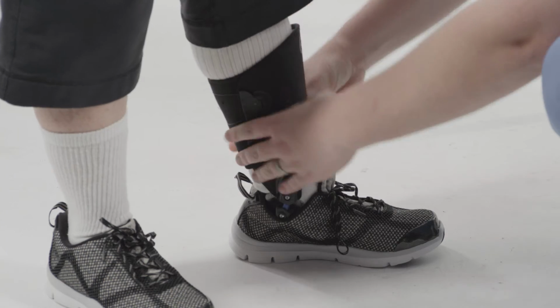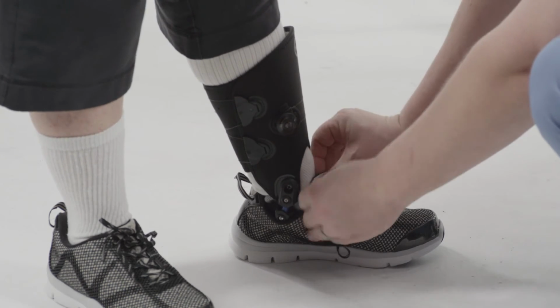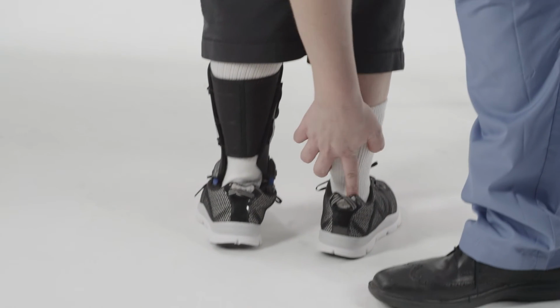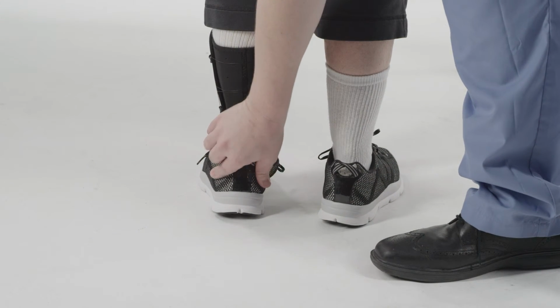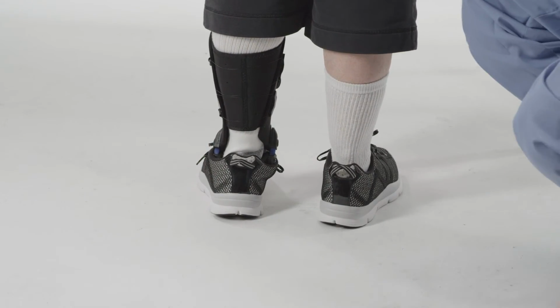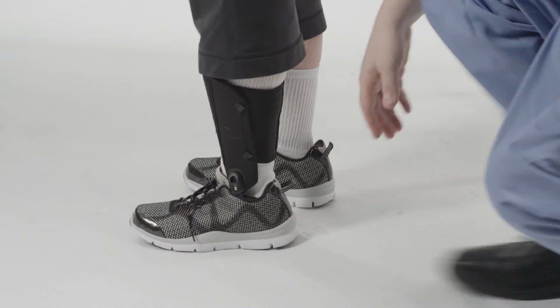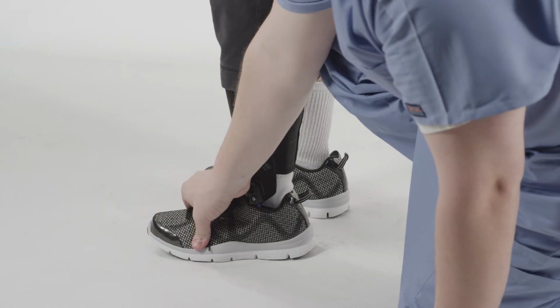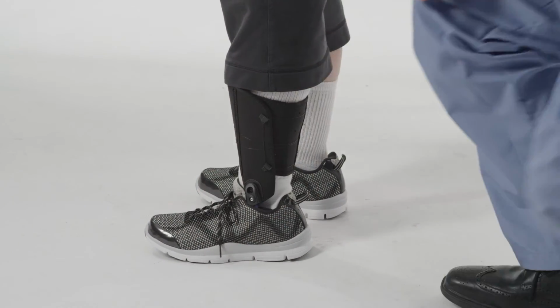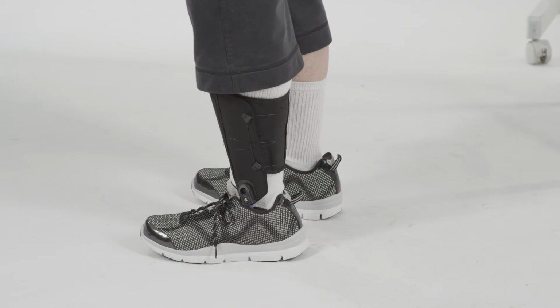After the initial fitting, some patients may require slight adjustments to their Exos free motion ankle brace, especially if they feel areas that may cause rubbing or discomfort. This is typically around the malleoli or other bony prominences. Because the Exos free motion ankle brace is reformable and customizable, these adjustments can be made quickly by a clinician.